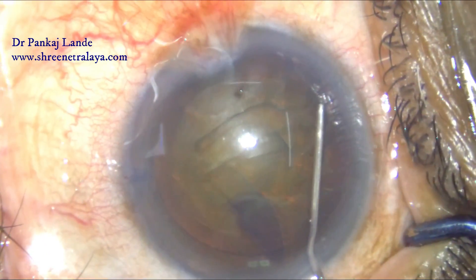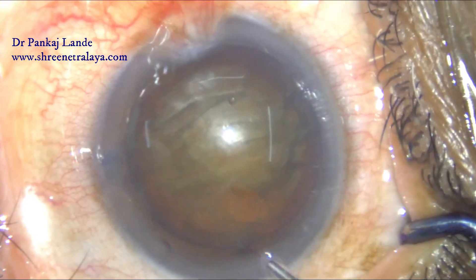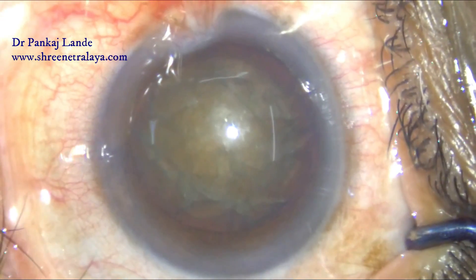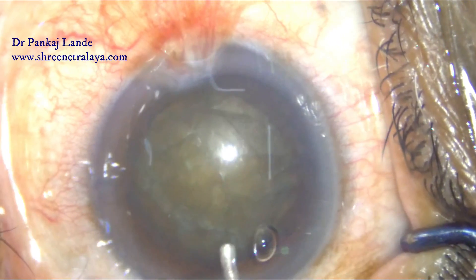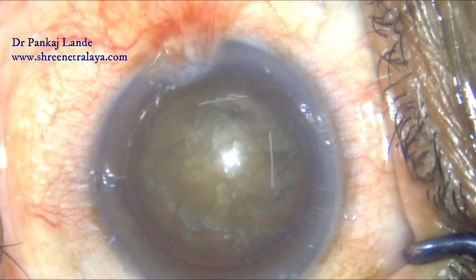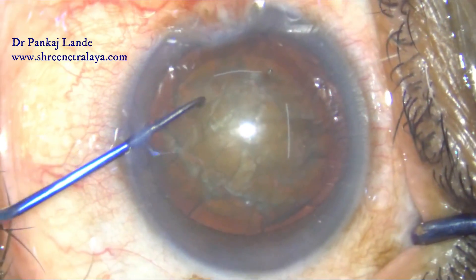Notice the hydrodissection wave and a nice rotation of the nucleus. Once you confirm the nucleus is nicely rotated, you can proceed with the pre-chopper. I have a chopper in my left hand through the side port and the pre-chopper through the 2.6 millimeter main port in my right hand.